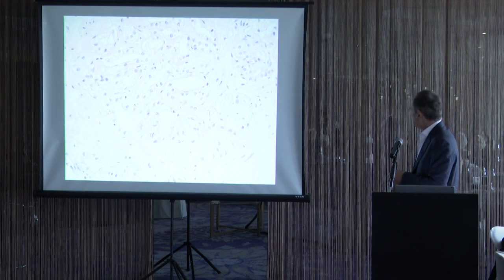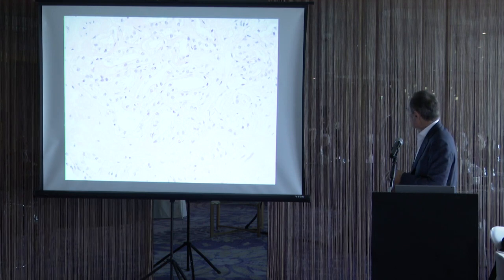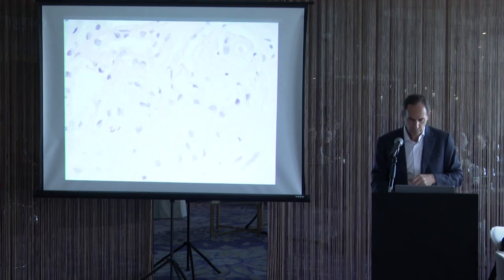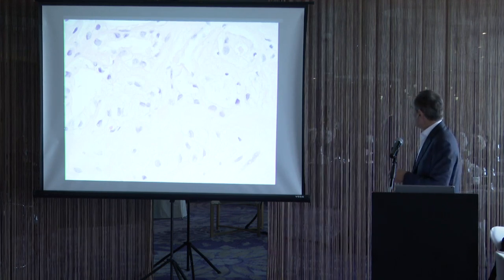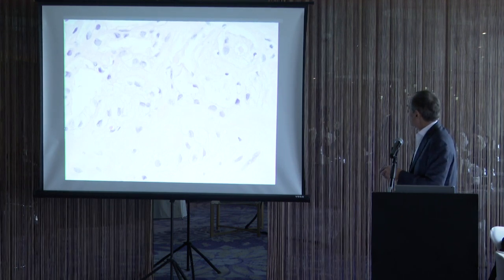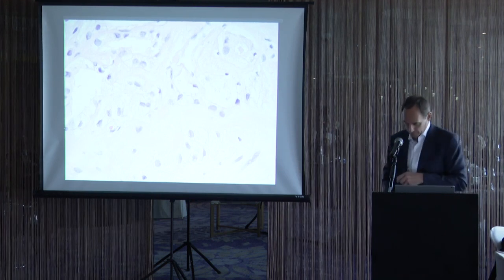Nuclei can be slightly enlarged, maybe small nucleoli, and you don't want to pay any attention to glands where you see maybe a cluster of just a few individual cells without gland formation. They're just tangential sections off of the partial atrophy. Here at higher power, nuclei go almost up to the top of the cell, so again, they're atrophic cytoplasm. A lot of cytoplasm between the nuclei, and then again, that little ruffling of the luminal border, ragged luminal border.